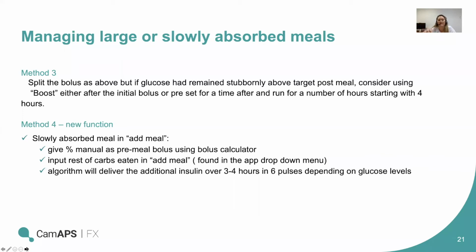And I think the important thing about the time that you potentially need boost on for is we quite often see people, even on normal pump therapy, when they split their boluses, only do their extended part over maybe 1 or 2 hours, but we know from a high fat high protein meal the glucose will continue coming through potentially for many hours after you've eaten. So maybe start with 4 hours. The great thing about boost is that it will only continue to boost when you're above target. If you drop down to target or go below target, it will stop boosting even though boost was still on, and then if you crept up again, it would boost again. So it's the safe thing to do to pop it on for 6, 7, 8 hours after you've eaten, and that's fine.